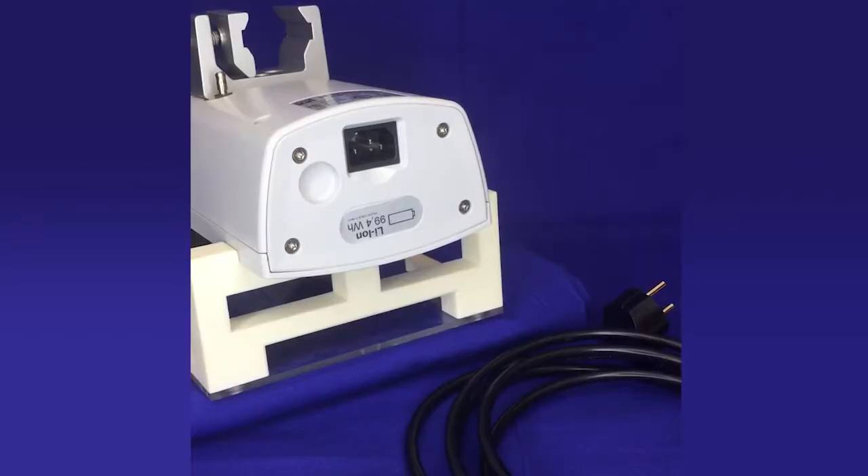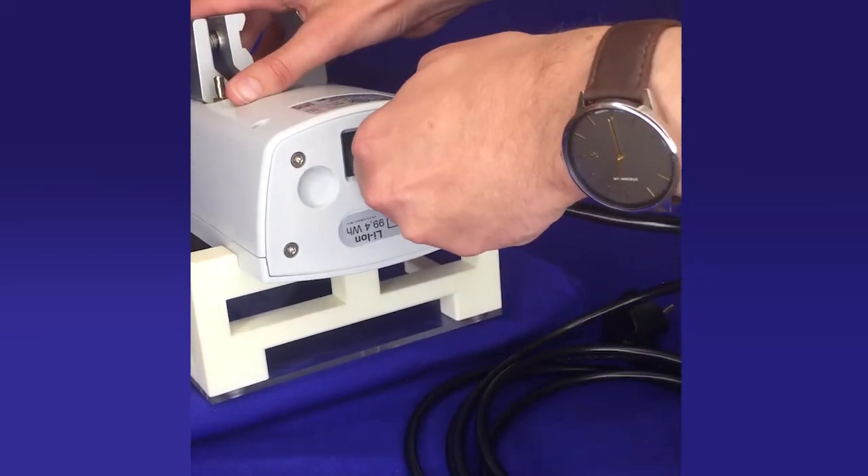Now plug the main plug into the socket. The device is now ready for use.